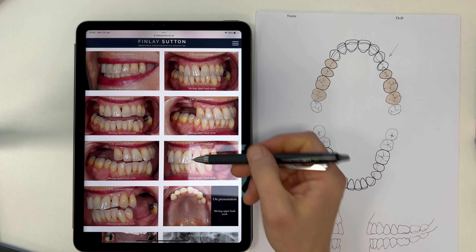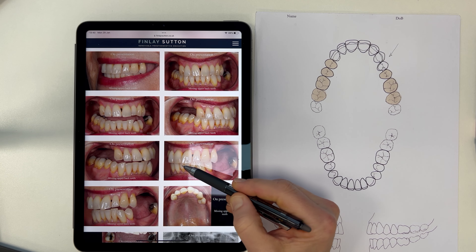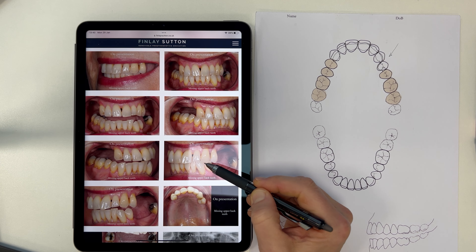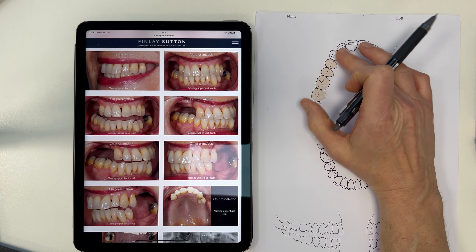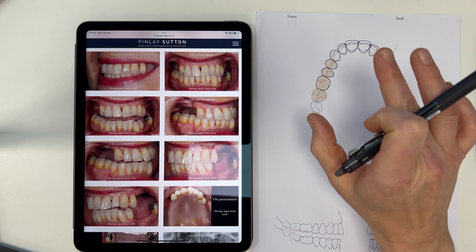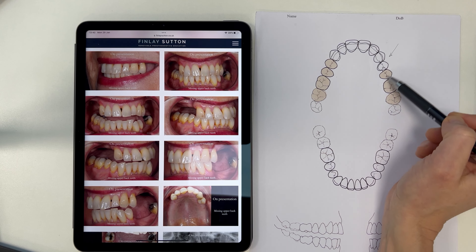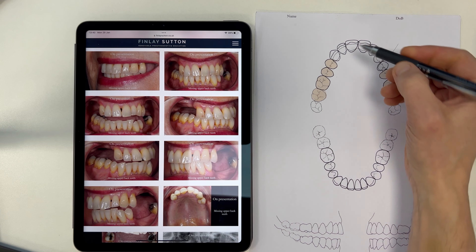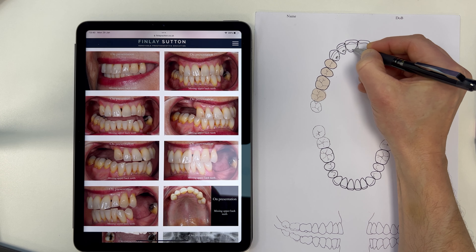She's got a class one — almost a class three occlusion, but I'm just going to call that class one. She's got a little bit of a cross bite just there. What I don't want to do is prop the bite open massively; I just want it opened up slightly so you can have a centric occlusion there and also centric occlusion on these back teeth too. I'm going to do subtractive rests on those underneath.